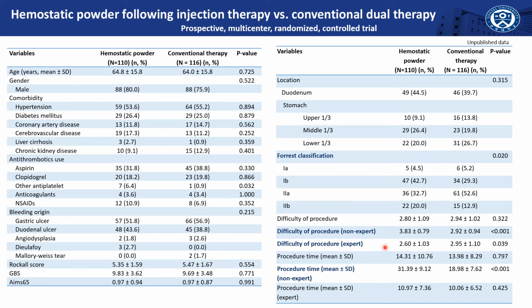As you can see, there's a very interesting result. We evaluated the difficulty of management using powder or conventional therapy, and we divided non-expert versus expert. In the non-expert group, the powder group seems more difficult, but in the expert group, the conventional therapy is more difficult.